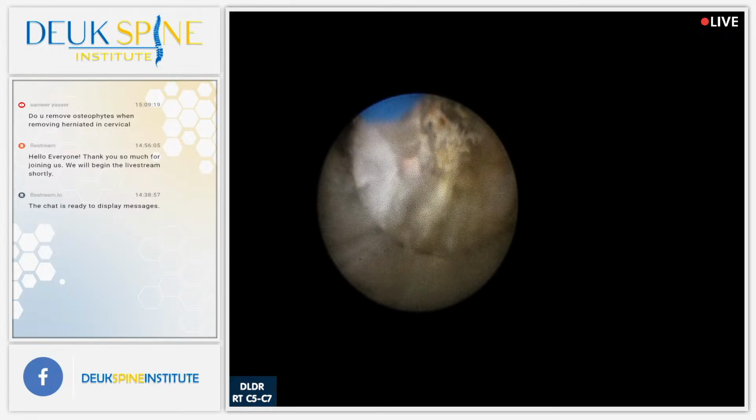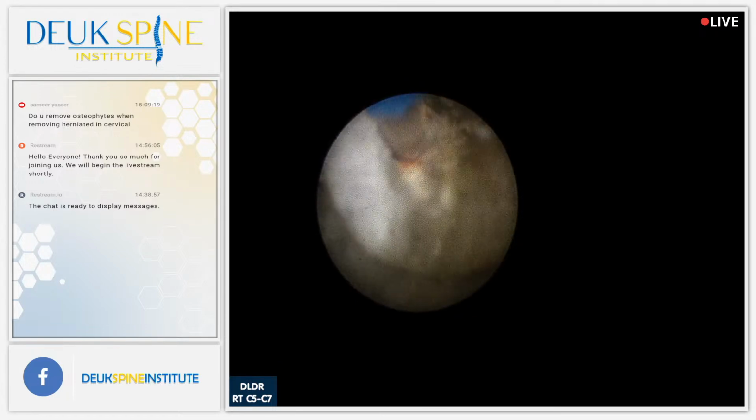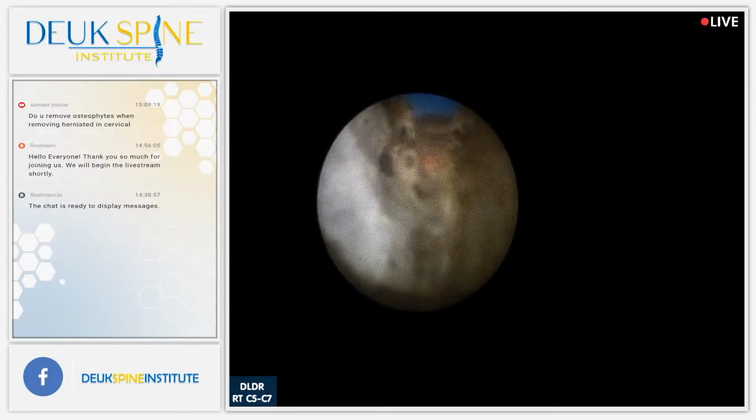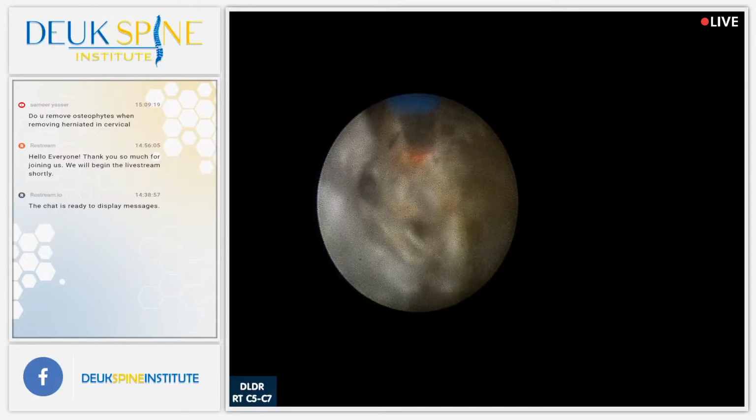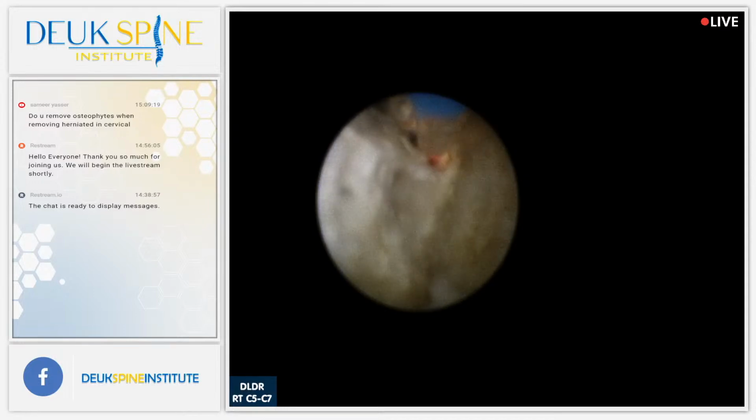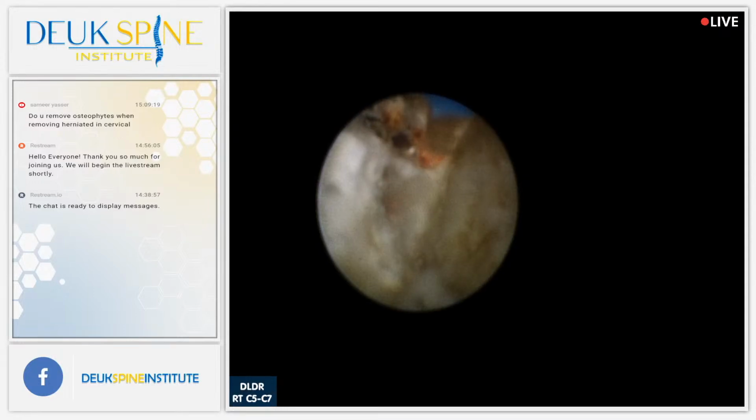Wow. That's why. He's got a lot of bone spurs. Had a lot of damage over the years to these discs. I think it's more related to his sports that he plays. But you see how the laser can easily remove these bone spurs.